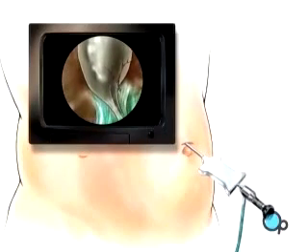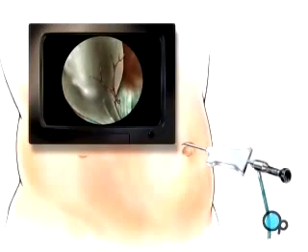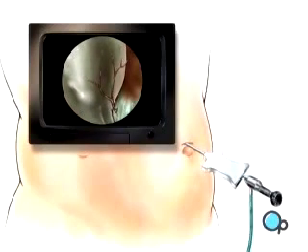During the procedure, the surgeon will use the laparoscope to find and identify the areas in your body of interest, as well as to guide any other instruments required for the completion of the procedure.